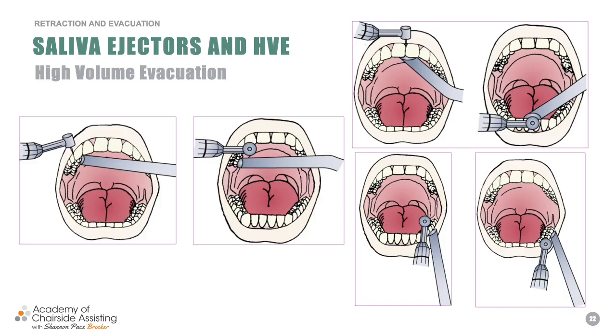And they're going to move up to that 11, 12 o'clock position. So they're going to be up and over, and I want to make sure that my suction does not cross over the mirror ever. And we'll talk about that here in just a minute. If they're working on the 8 and 9 area, or the 1s, for those that are in Canada, that suction is going to go right behind those front 2 teeth. You see where it is?